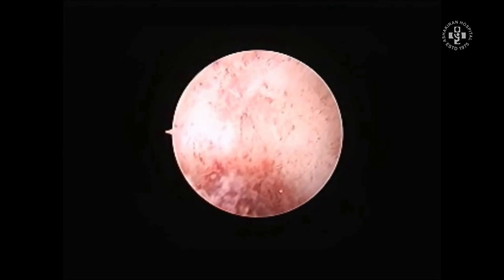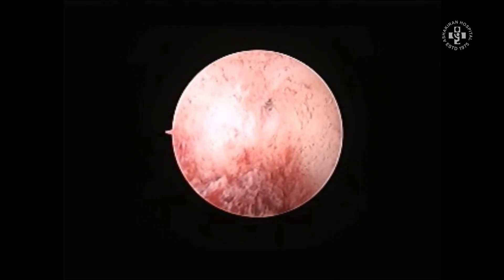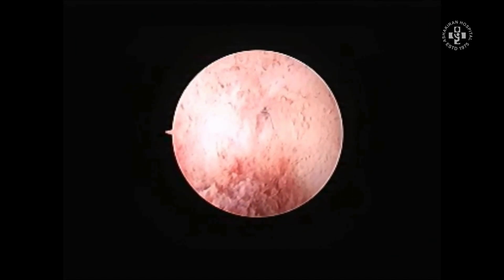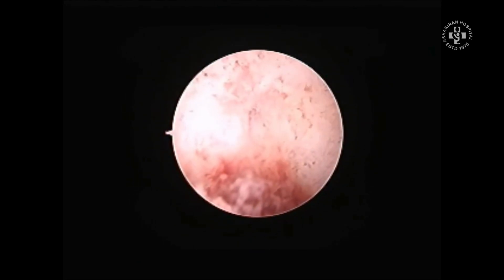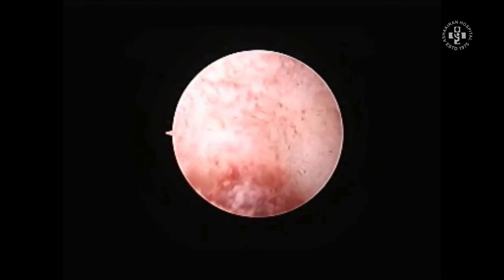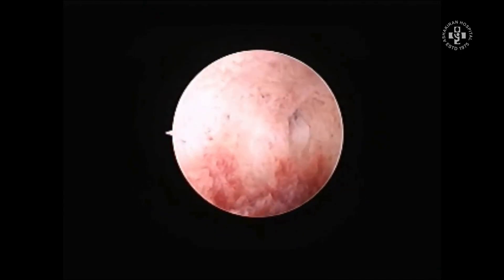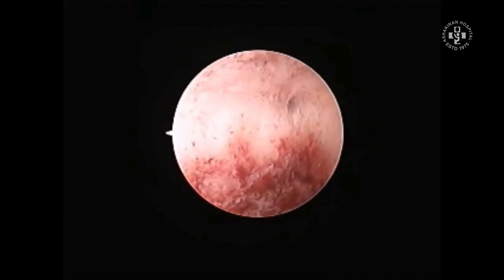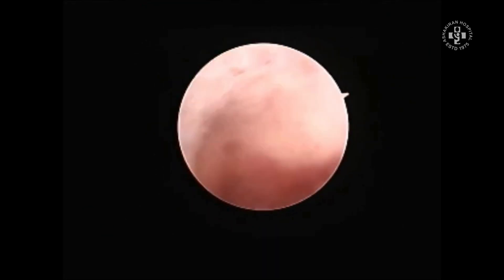Hello friends, welcome. We are going to demonstrate the functionality of the tubes by hysteroscope. You can see these are the ostia with the pressure effects. You can see the dynamicity of the ostia, which can be documented. The ostia opens up with high pressure, and if you reduce the pressure, the ostia is going to get closed. This is usually done when you are doing the assessment for fertility and the patency of the tubes.